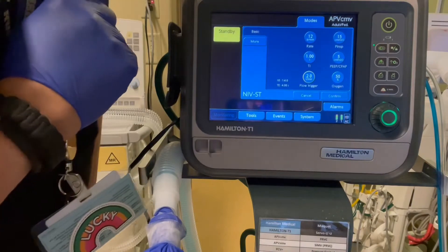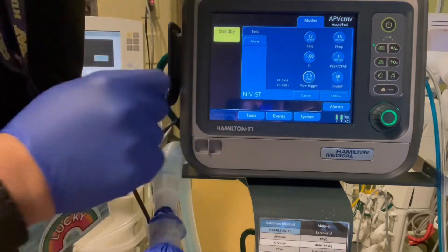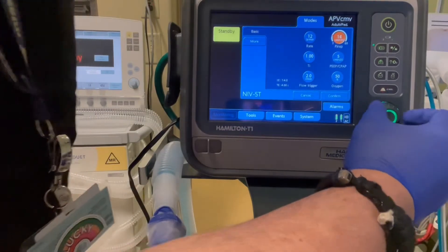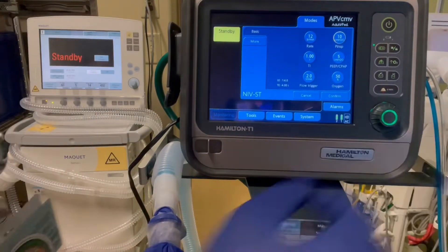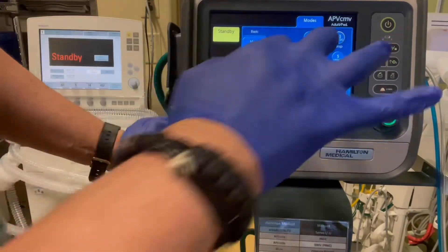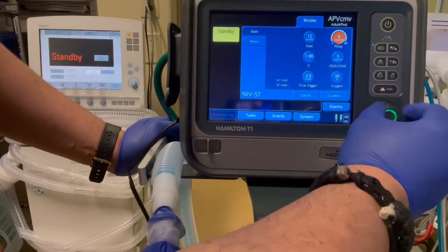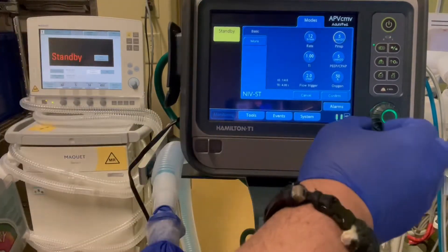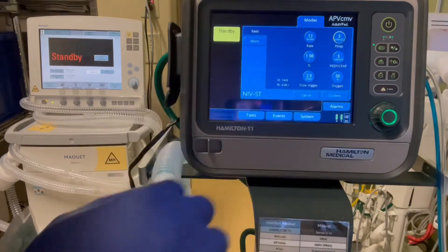This is very important. We're going to set this differently than we're going to set a V60. On a V60, if we wanted to do 10 over 5, we would just set 10 over 5. But this is additive, so you'll have to subtract the P — we're actually setting the pressure support. So if you're going to set 10 over 5, you would do 5 over 5. Very important — so 5 over 5 would be a 10 over 5.